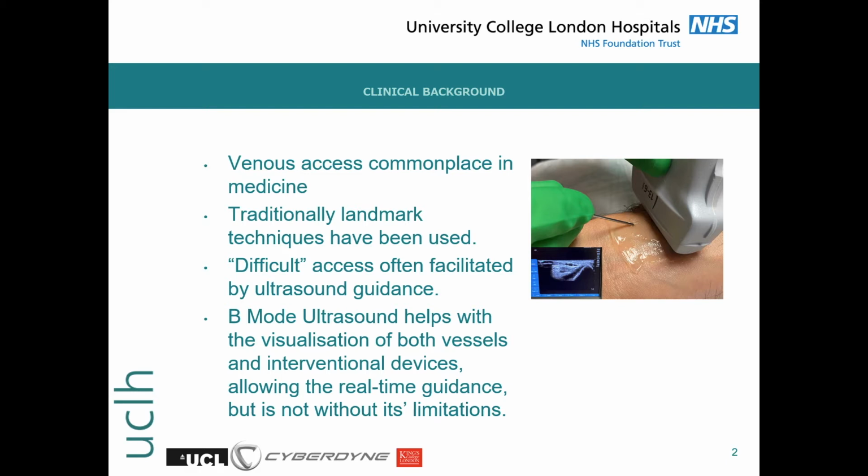Indeed, advice from the National Institute of Clinical Excellence in the UK is to always use ultrasound for central venous access procedures. B-mode ultrasound helps with not only the visualization of vessels, but also the interventional devices used to access the vessels and those being inserted into the vessels, allowing the prospect of real-time guidance from start to finish. But it's not without its own limitations.